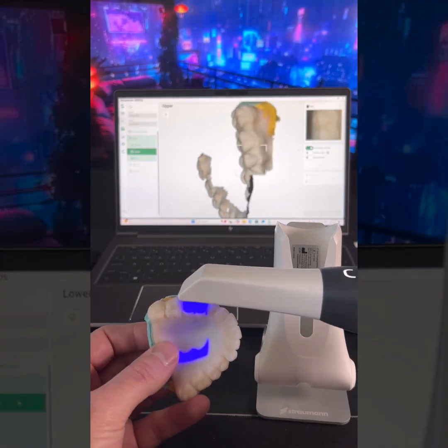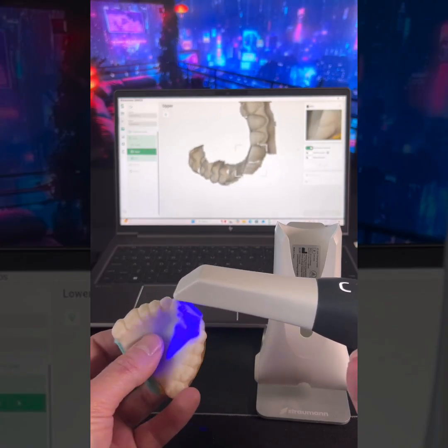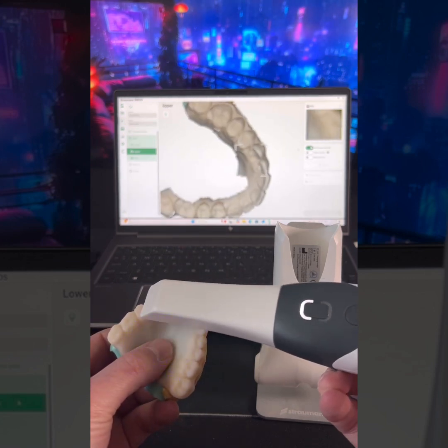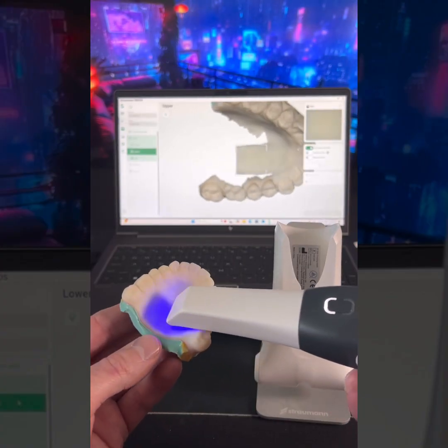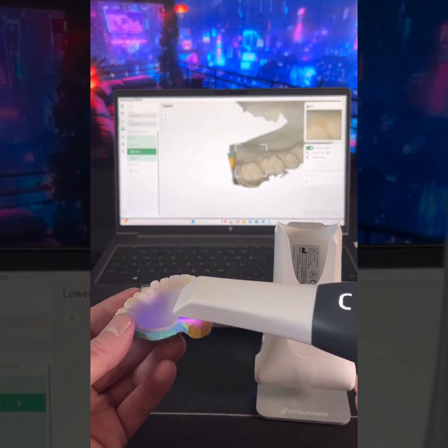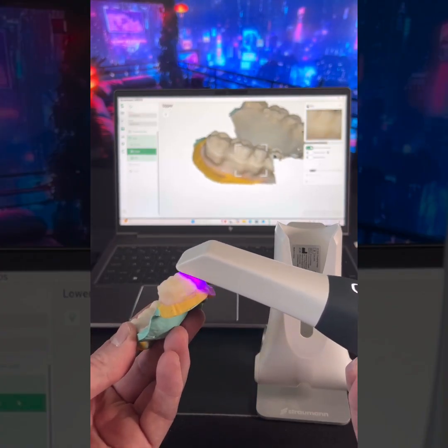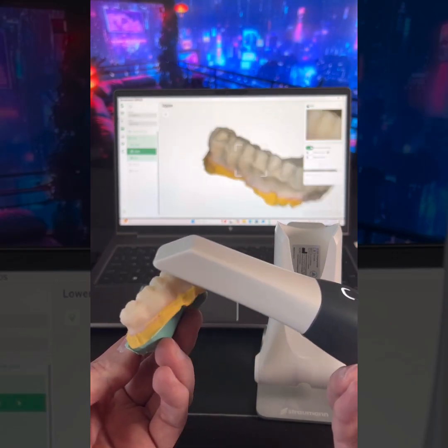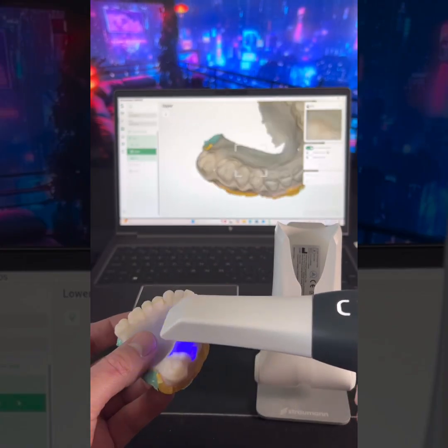So far, so good on the colors. It's really nice, actually. A lot of times the palate is really difficult to pick up. It's got a very smooth feel to it. I'm gliding over it just like this, and it's picking it up really nicely.